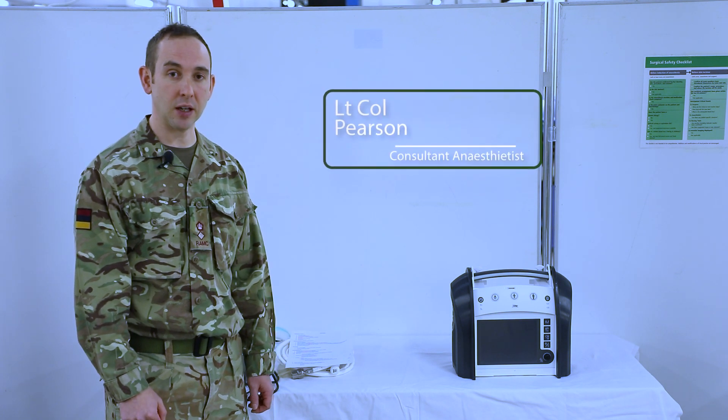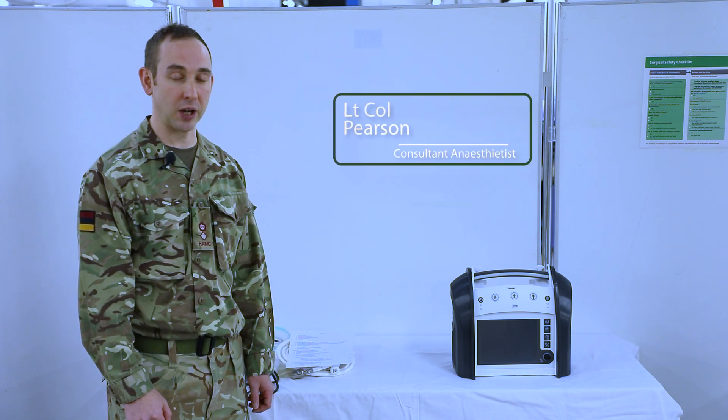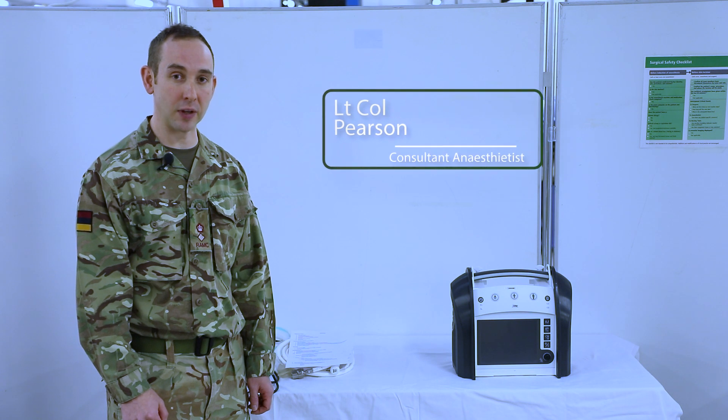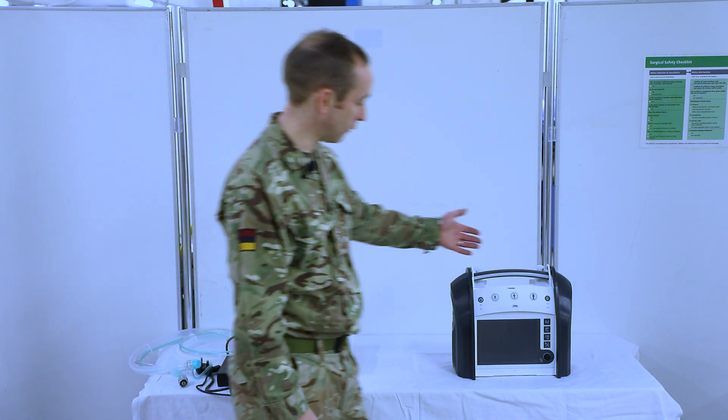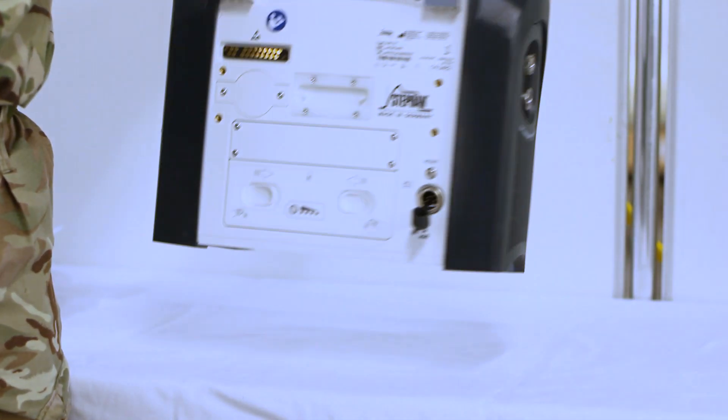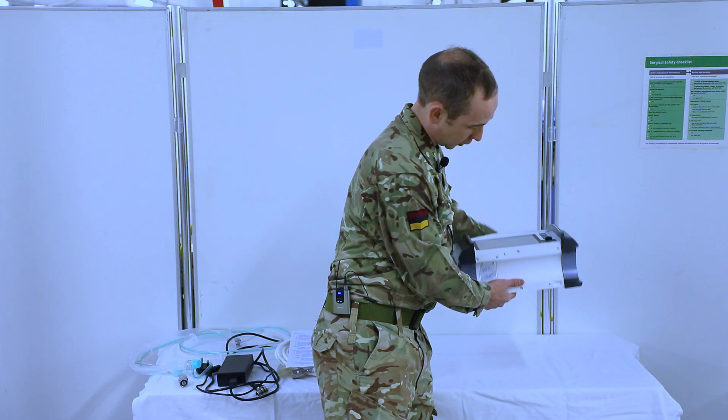The next part of the 373 is to ensure that we do a physical check of the machine itself and also the ancillaries. The first part of this is just to check the whole machine for dirt and damage, so do a complete inspection of the Eve itself and including underneath.